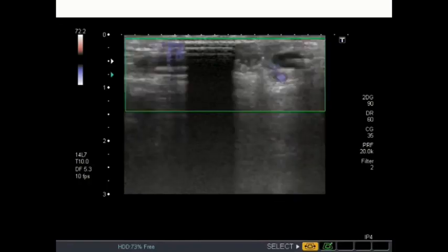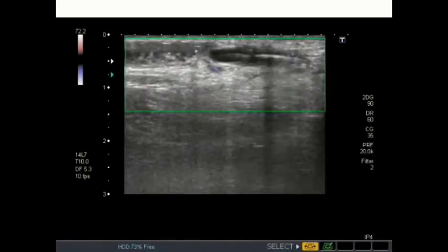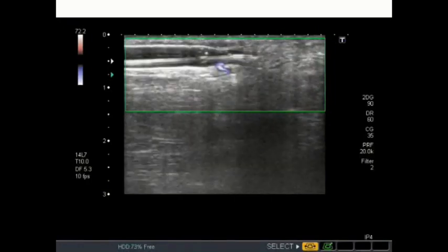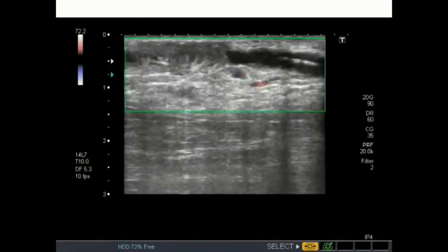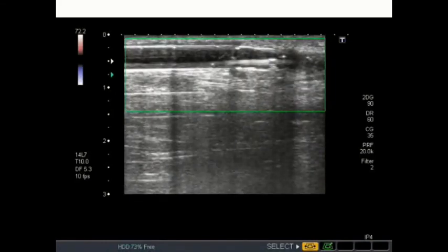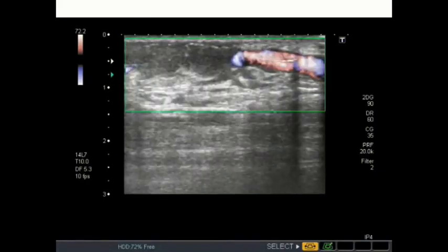And after rupture, we inflate the balloon like this. But sometimes the point is not a good point of the balloon, so that we can see the rupture point. Then we move the balloon to the proper side, and then there is no rupture here.